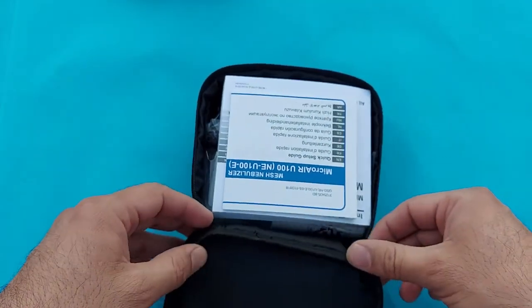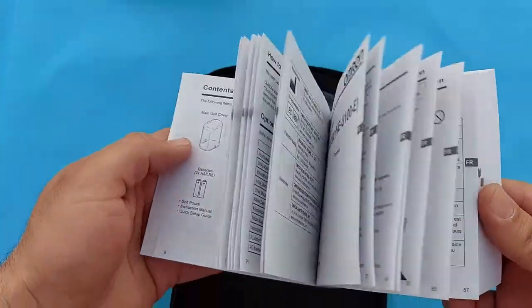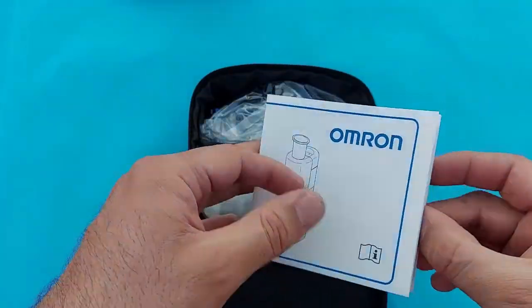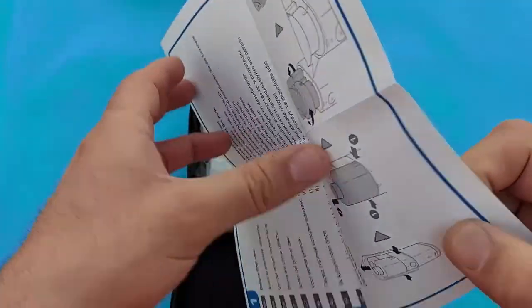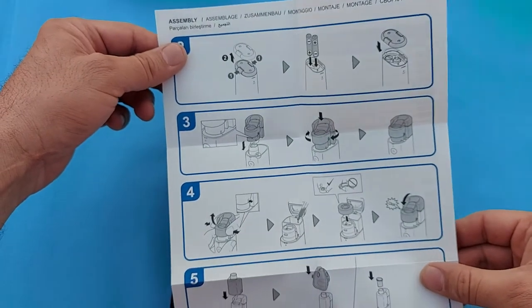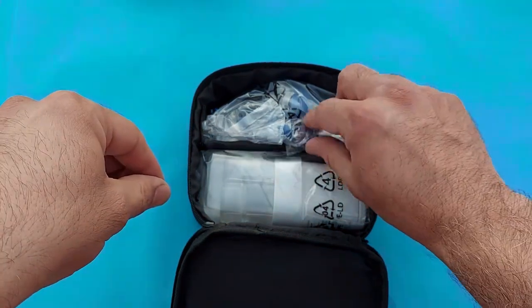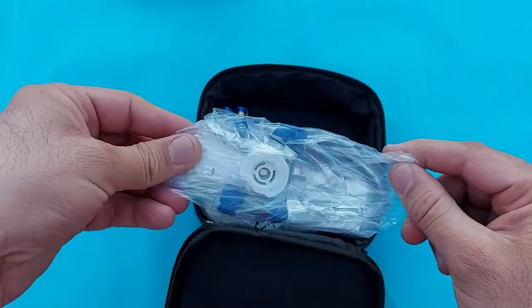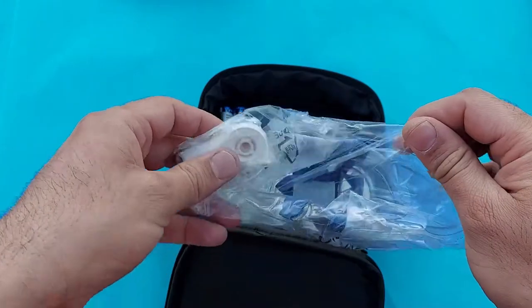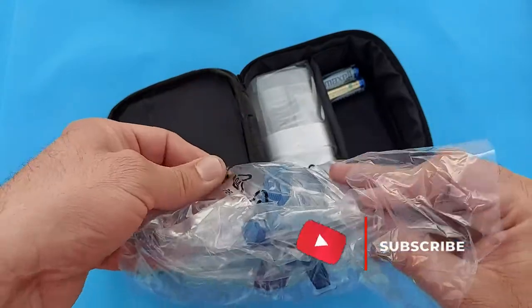You can see here a manual — this is a booklet. It will show you how to make settings in this device and how to assemble and disassemble the nebulizer machine. You should read it before using the Omron Micro Air. As you can see here, there is a mask inside, including an adult mask, a pediatric mask, and a mouthpiece.